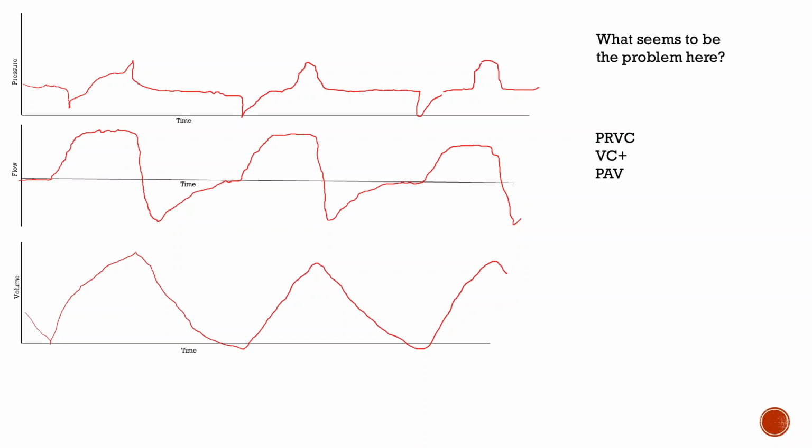I'll give you that the tidal volumes for this patient are probably... no, I can't give you that. I should have given you numbers, but let's say this number right here is 10. So this is 10 centimeters of water.